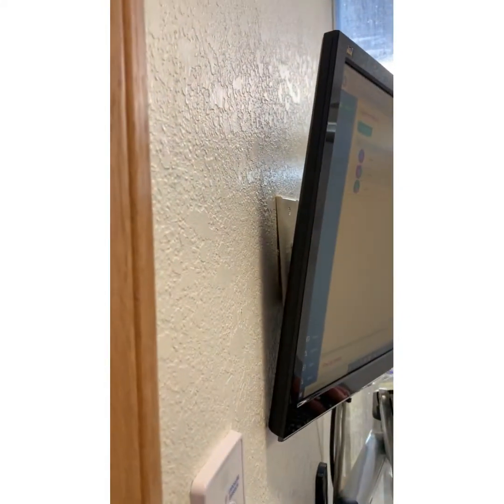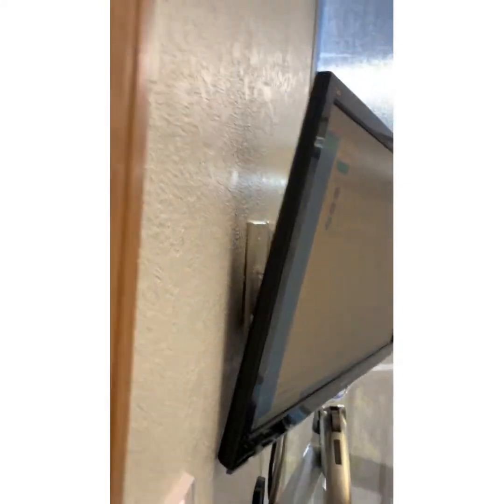There it is. All right. Ta-da. Here we go. So eventually, you can probably stand back here and see it even better.